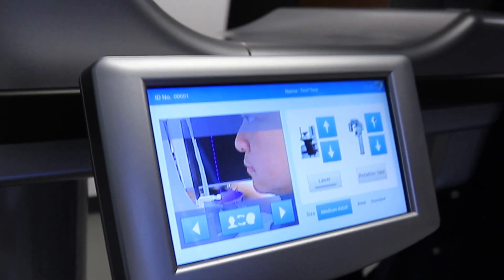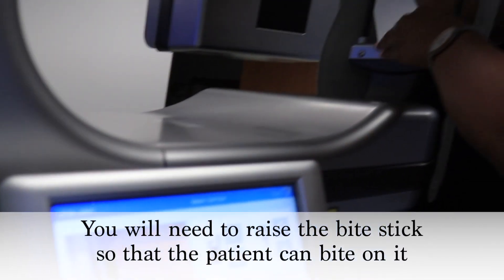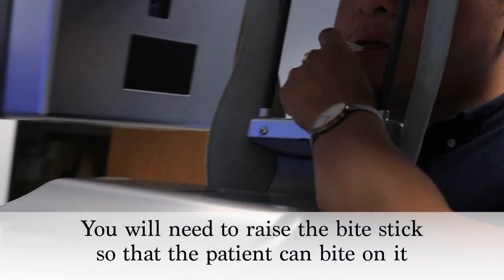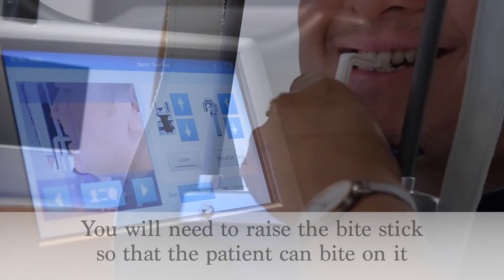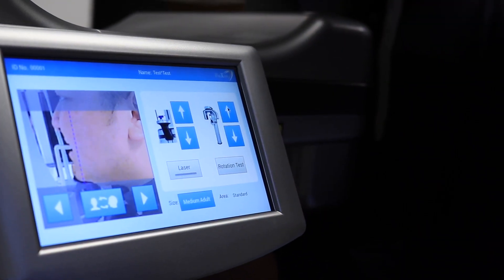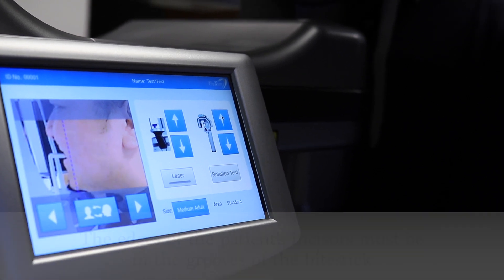Then bring the patient into the chin rest and into the bite stick. The edges of the patient's upper and lower incisors must be in the grooves of the bite stick.